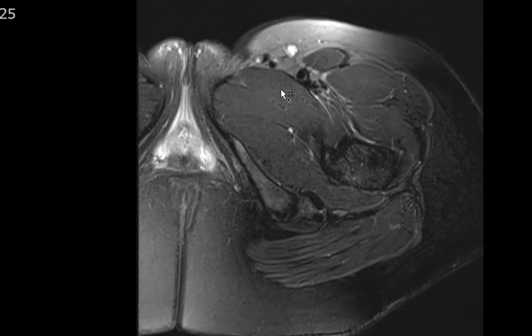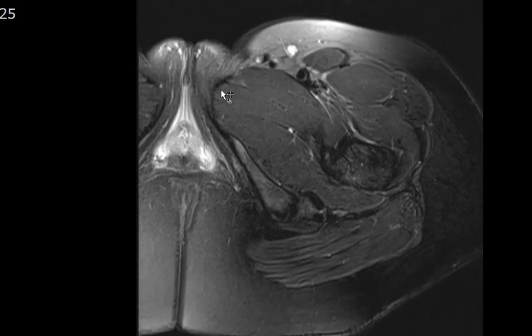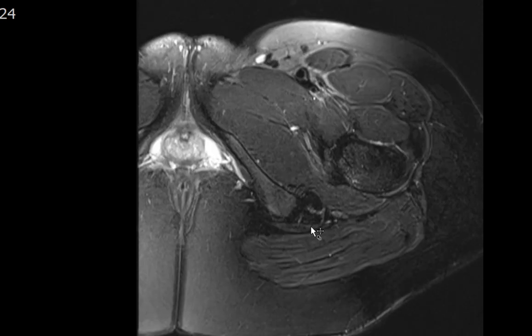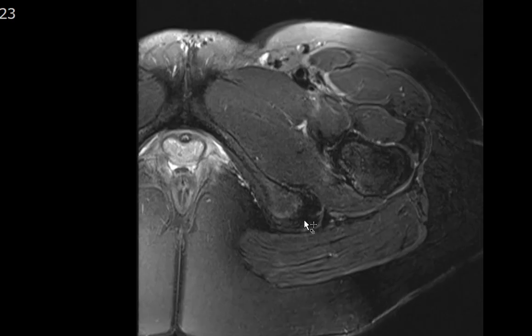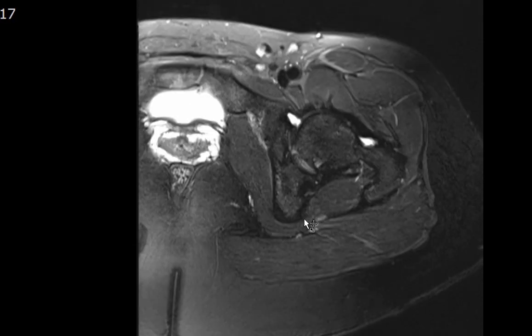It's important to look at the adductor muscles — adductor longus, brevis, and magnus — whose tendons insert onto the pubic symphysis. They are normal with no adductor tendon tear. The hamstring tendons — two dark hypointense structures — insert onto the ischial tuberosity. The more anterolateral structure is the semimembranosus, and the more posterior structure is the conjoint tendon of the semitendinosus and biceps femoris. There may be some trace peritendinitis along the semimembranosus tendon insertion at the ischial tuberosity, but overall the tendon is intact with no tearing.